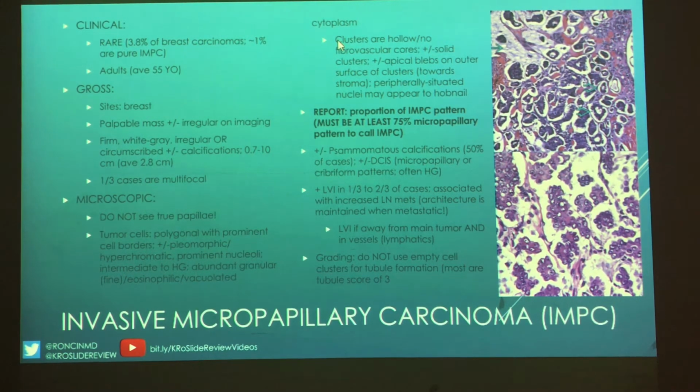Okay, we talked about a lot of the stuff, so the cells, they may or may not be pleomorphic, hyperchromatic. The example that we have, they are very pleomorphic, very hyperchromatic. There's nucleoli everywhere, and it's very high grade. And the cytoplasm, where you could see it, maybe it's more granular. I think there's a lot more vacuolated parts.